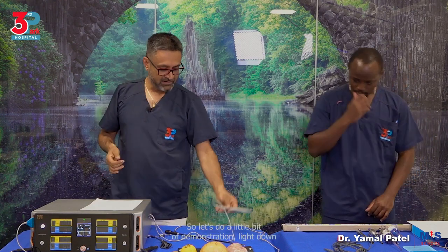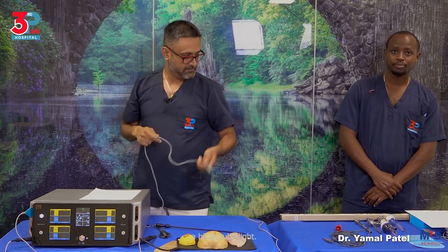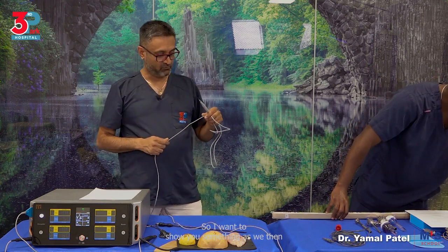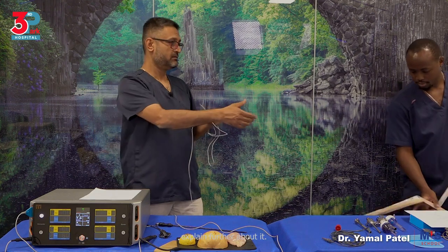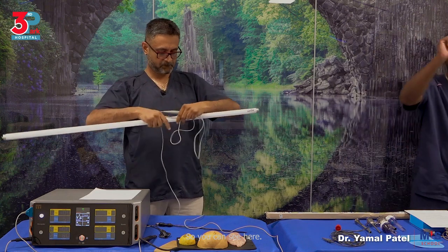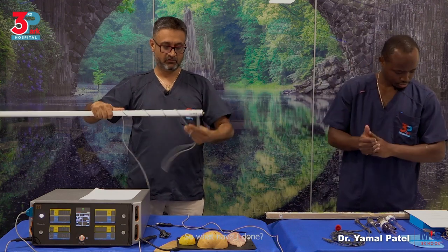So let's do a little bit of demonstration. Light down a bit, tube light. So I want to show you something as we then explain further about it. So you can see here, so what have I done?